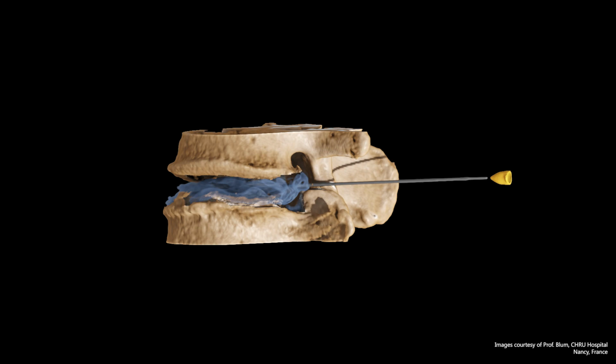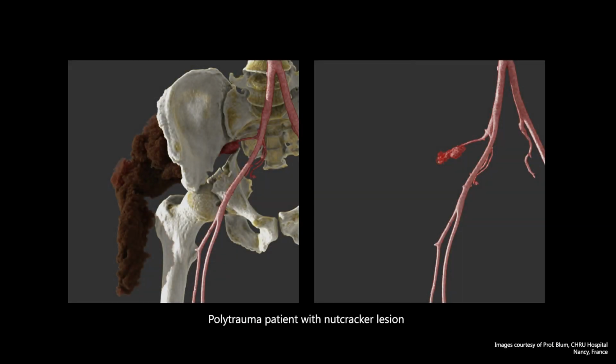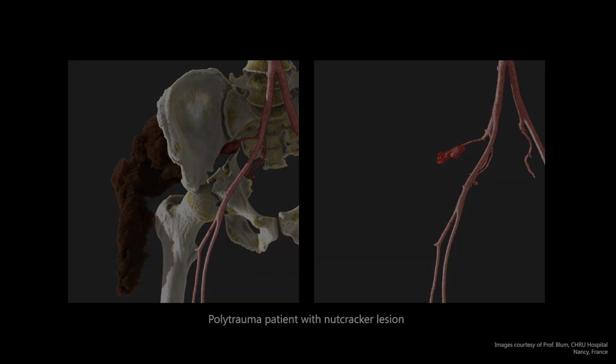And finally, a good 3D image is also a quality checking tool, because to get a good image it requires a good acquisition, a good choice of reconstruction parameters. So when you get a good 3D image, it just tells you that the acquisition was done in a good way, in a good manner.